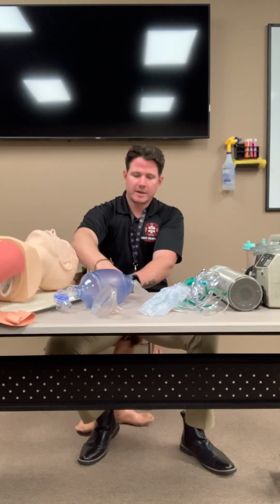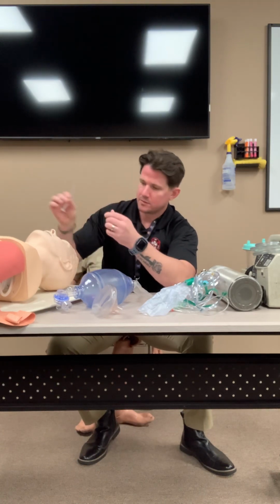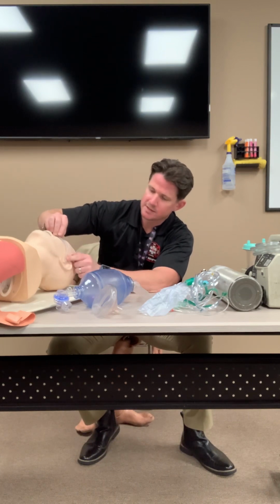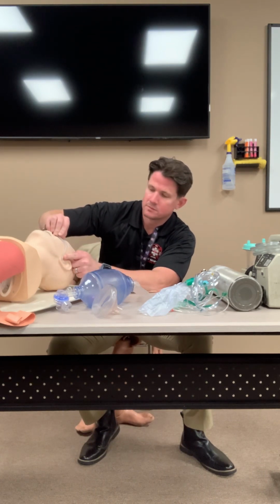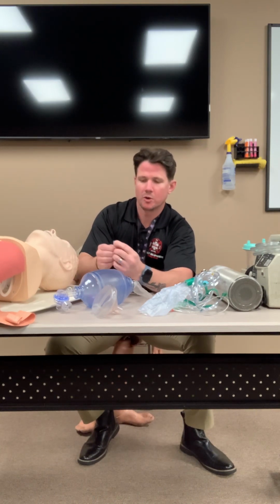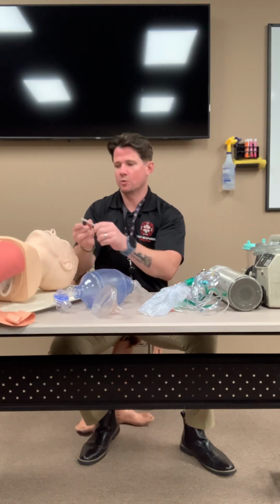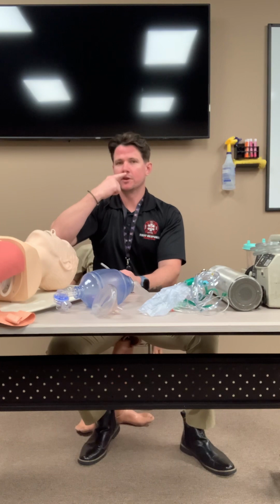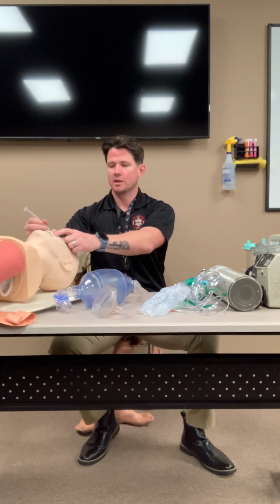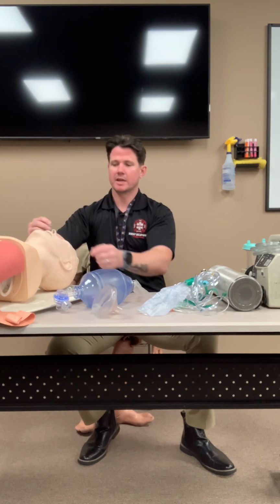When we're talking about the NPA, right, we want to make sure that we lube it up, all right? Measure it from the corner of the nose to the tragus or to the earlobe, all right? Once we've measured it and it's lubed up, we're going to go bevel toward the septum. So the bevel side is going to go toward the septum of the nose, right? Whether you go right or left there, that's up to you. But we're going to go bevel toward the septum, and we're going to insert the NPA.